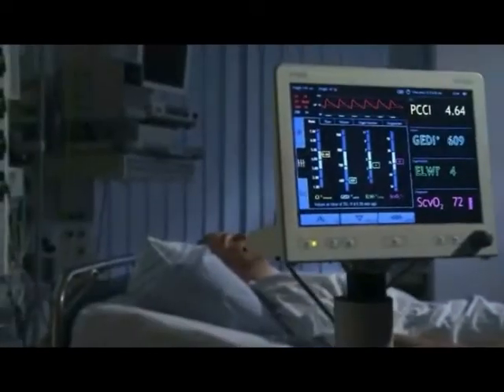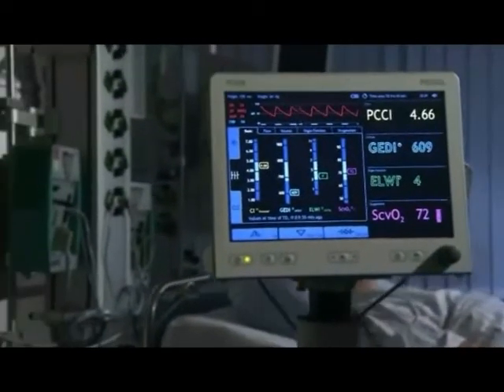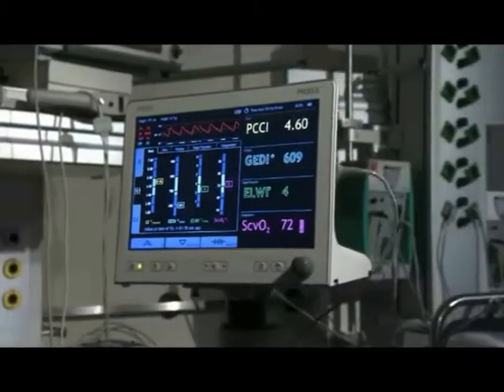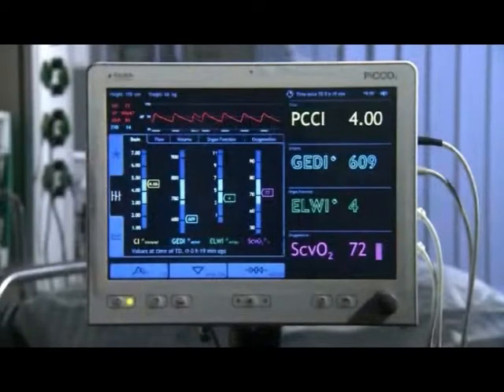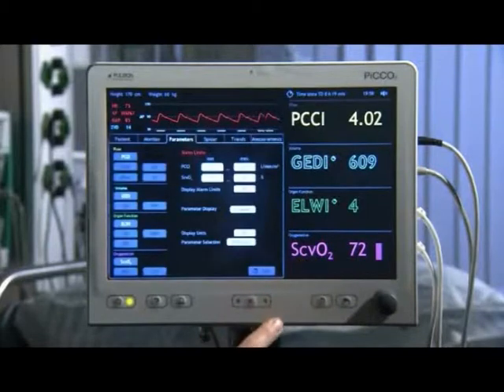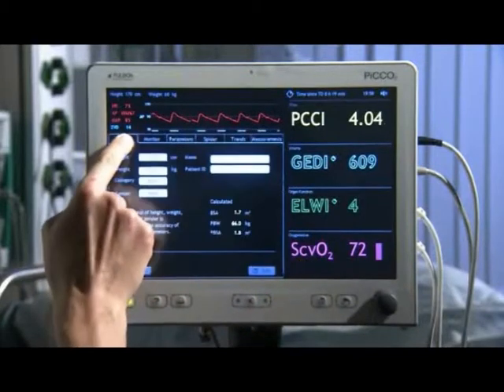The new Picco₂ for hemodynamic monitoring in the emergency department, operating theatre and intensive care unit. The device can be operated intuitively via the touchscreen, the navigation aids and via the function keys. The touchscreen functions when you touch the screen. You can also enter numbers or text directly.